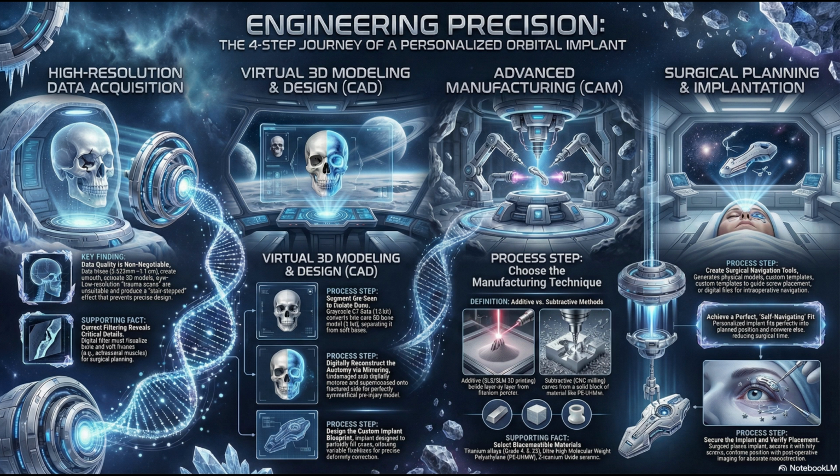You could blind the patient. This just proves that a precise self-navigating fit, which you only get from perfect digital data, is the best defense against surgical error. The implant should only want to sit in one correct position. The self-navigating concept is powerful, I'll grant you that. It simplifies the surgeon's job. It cuts down on OR time. The surgeon's first job is making sure the radiologist gets them the data they need to achieve that fit.